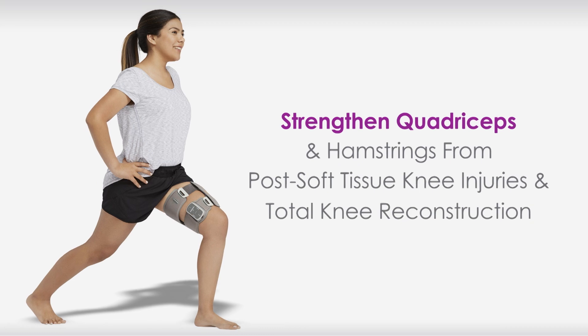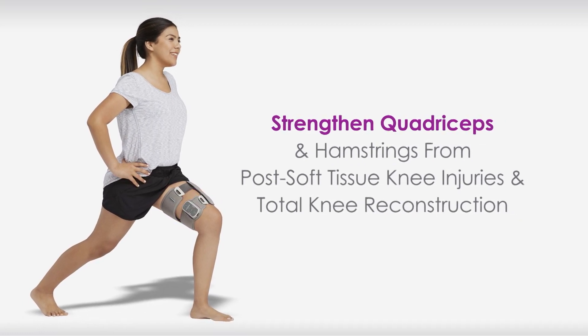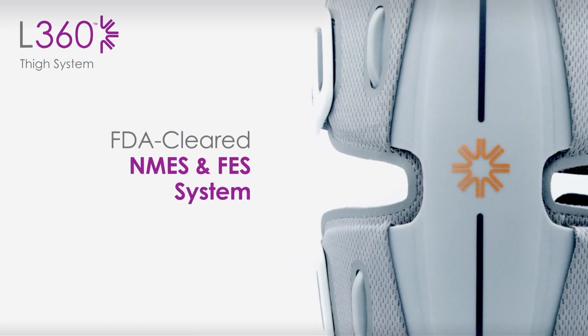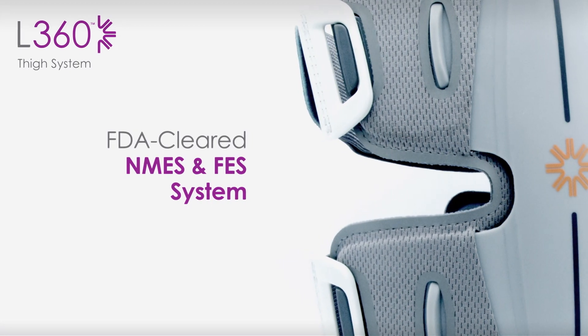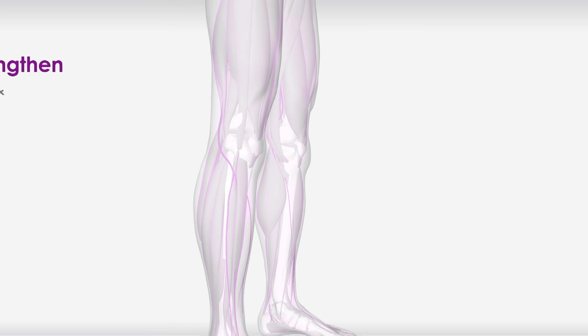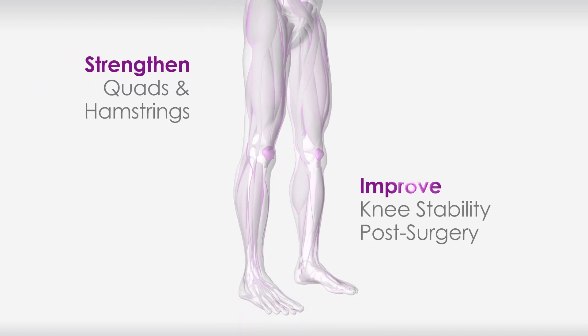Strengthen quadriceps and hamstrings from post soft tissue knee injuries and total knee reconstruction with the L360 Thigh System. An FDA cleared neuromuscular electrical stimulation and functional electrical stimulation system to integrate therapy seamlessly with your lifestyle. Strengthen your quads and hamstrings and improve knee stability post-surgery.